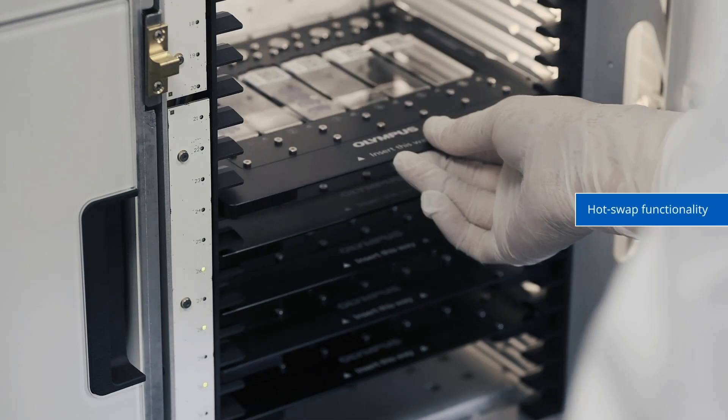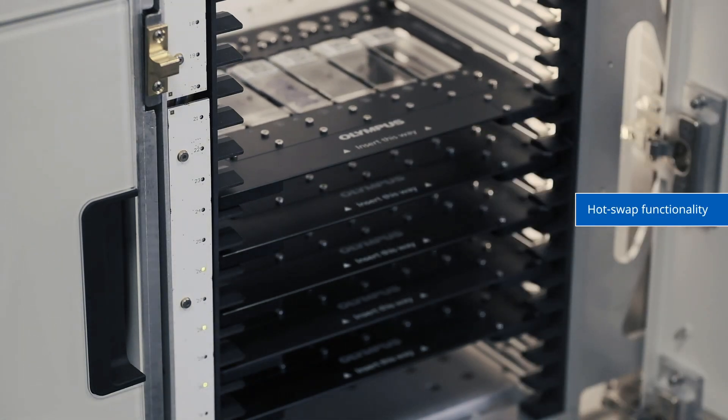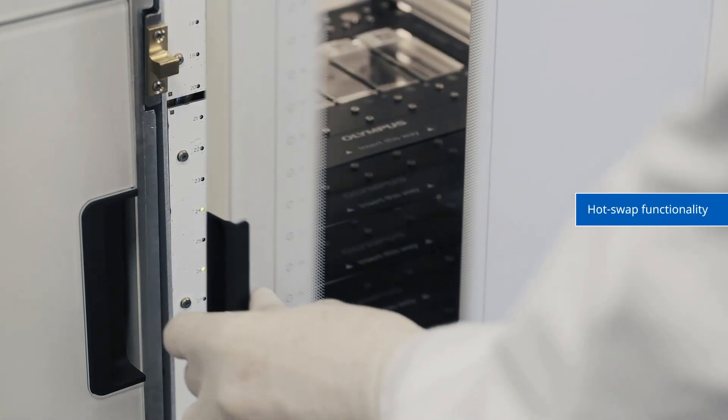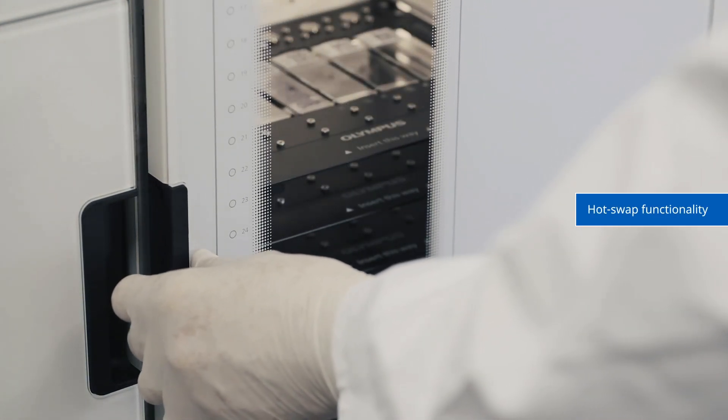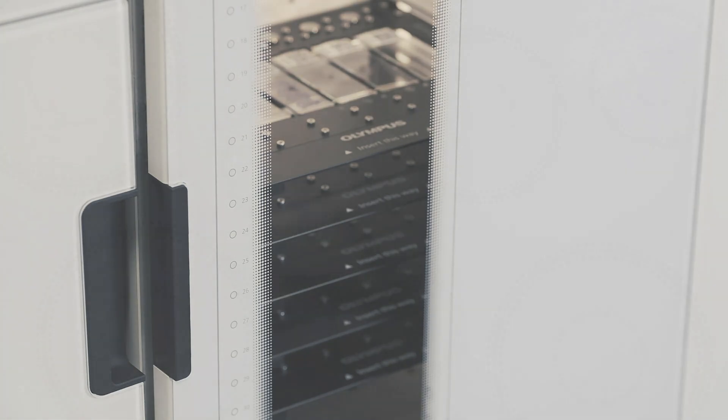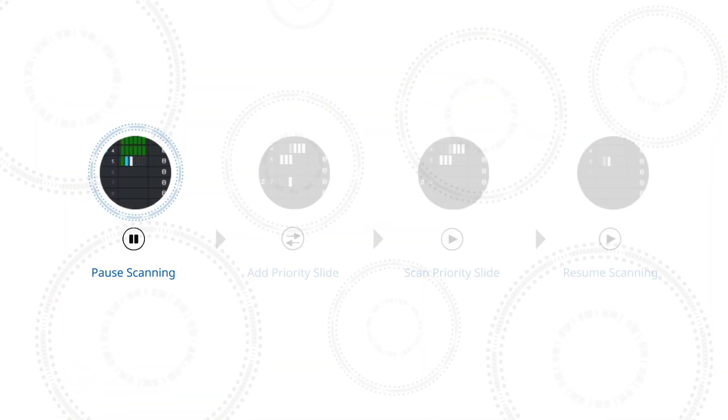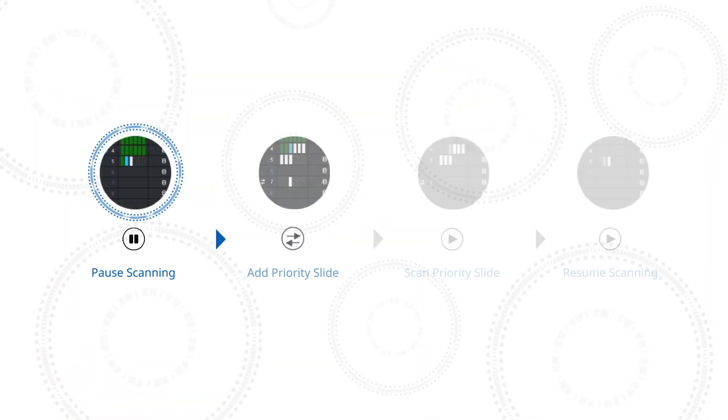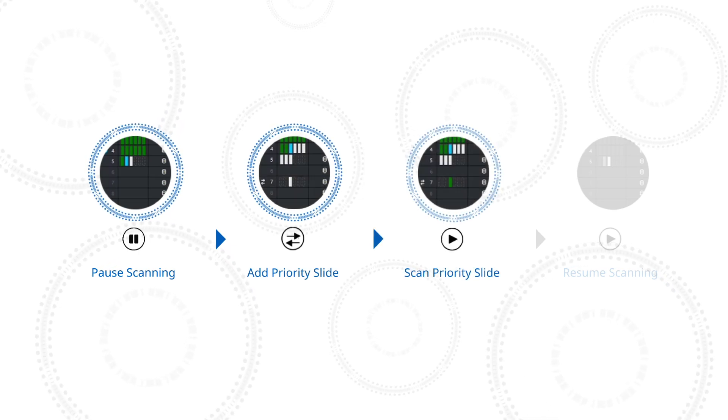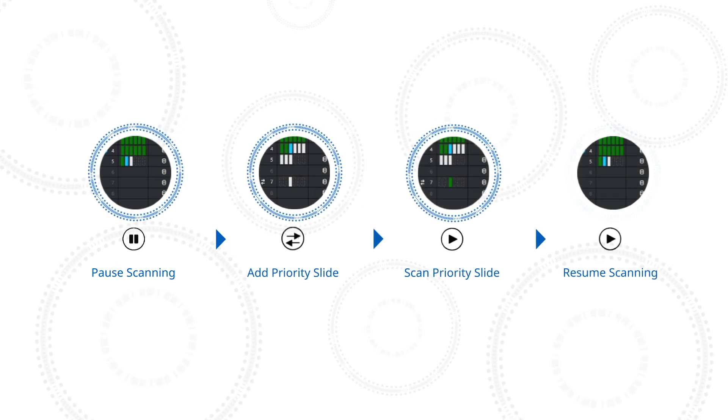Hot Swap functionality enables you to add additional trays to the loader before all the trays in a given project have been scanned. Scans can be interrupted as needed and then resumed where the scan left off.